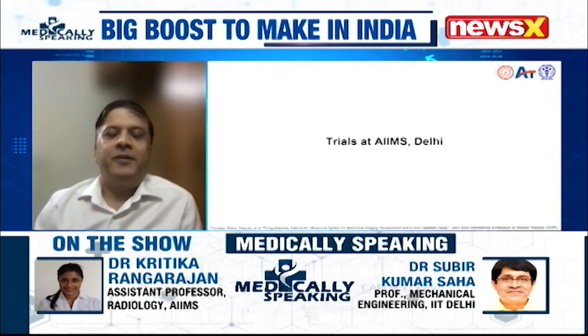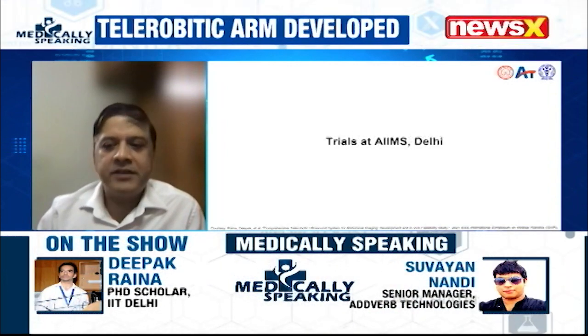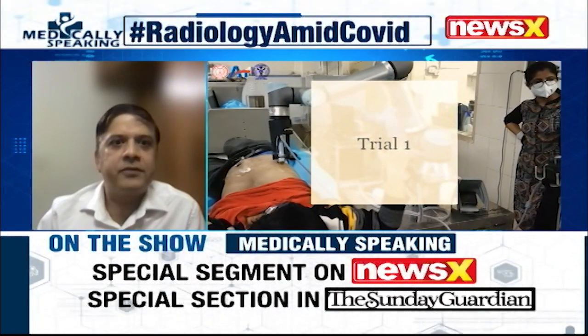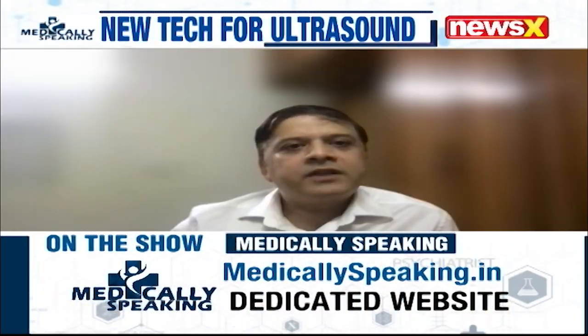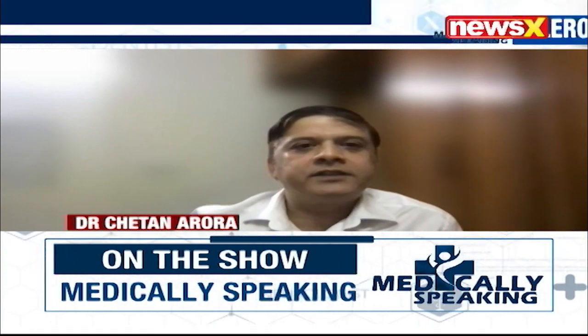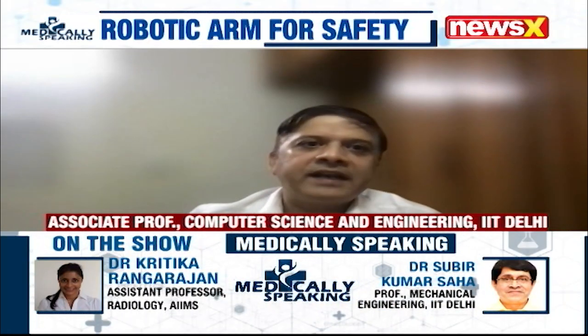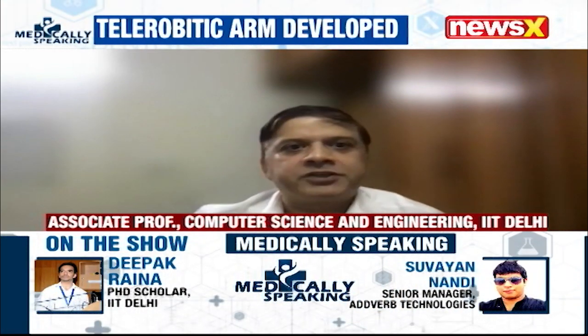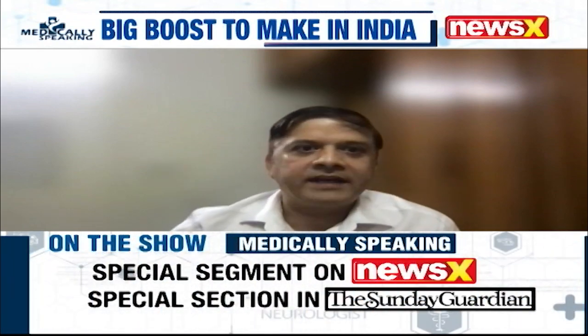Yes. So as Dr. Chandrasekhar was also mentioning, one of the key requirements at this moment in the ultrasound is that the doctor has to stand by the side of the patient. Now, if you think of it, this requirement is basically arising because the doctor has to hold a probe on the patient. Otherwise, it's easier to transfer the picture through the internet to another building, another room. So looking at the picture by itself does not require the doctor to stand. The requirement is arising because the doctor has to stand, hold the probe, and put a certain amount of pressure on the patient to get that picture right.